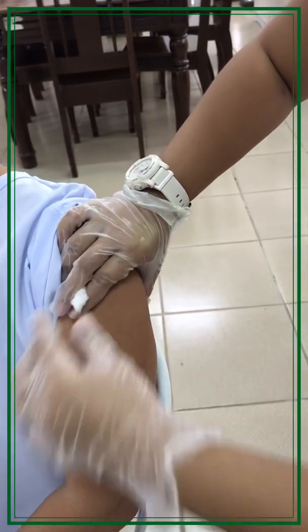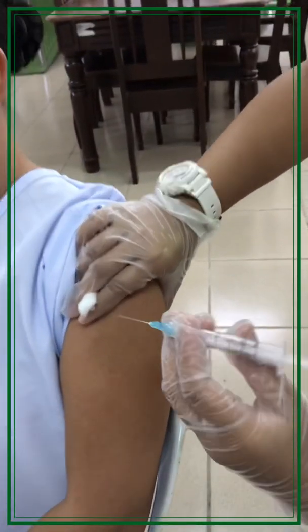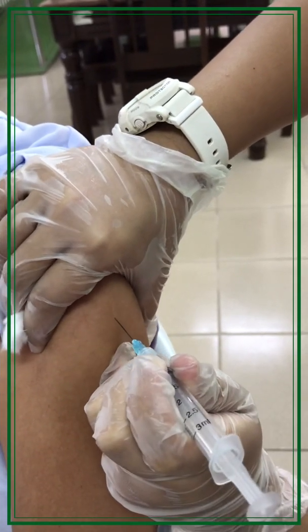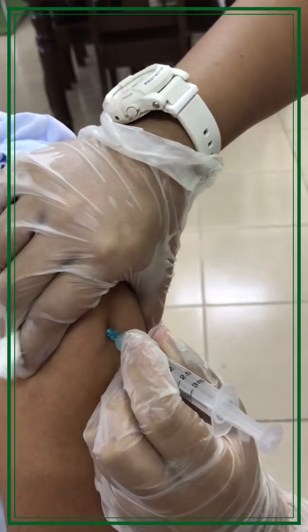With the non-dominant hand, pinch the deltoid muscle and place a cotton ball between the fingers. Using the dominant hand, hold the syringe between the thumb and fingers like a dart. Insert the needle quickly at a 90-degree angle.